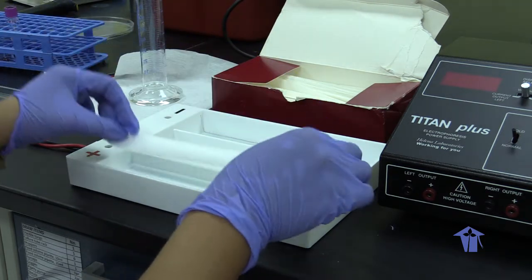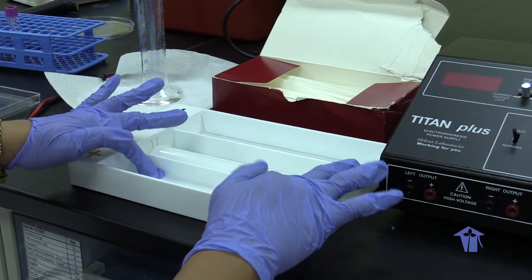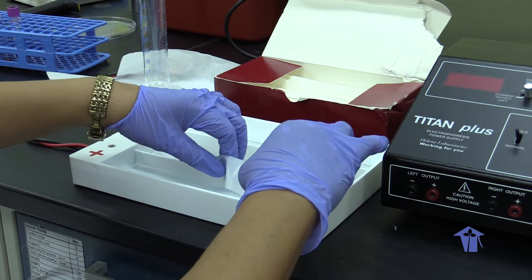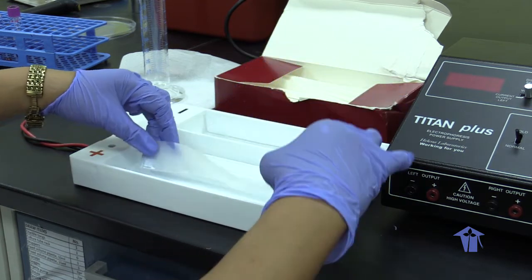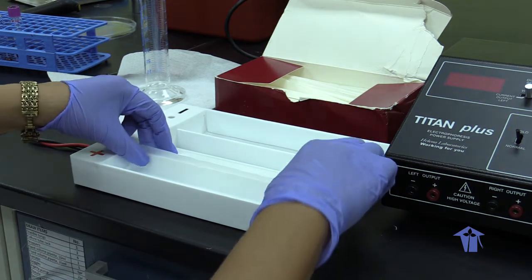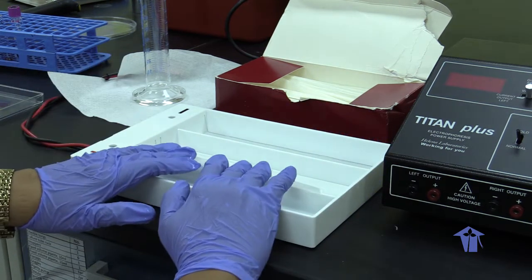So we place the wick into the buffer. Ensure that the bottom is in solution, and we fold.